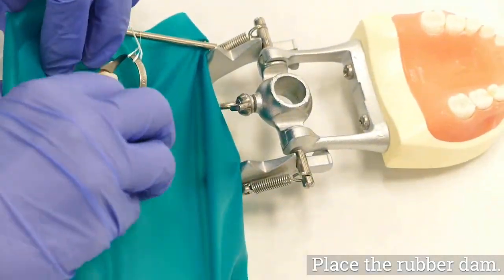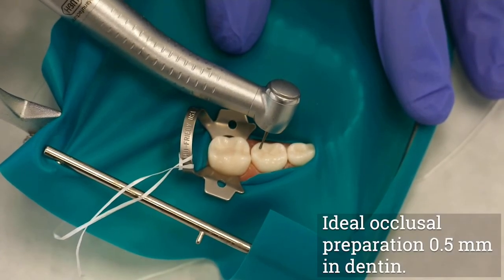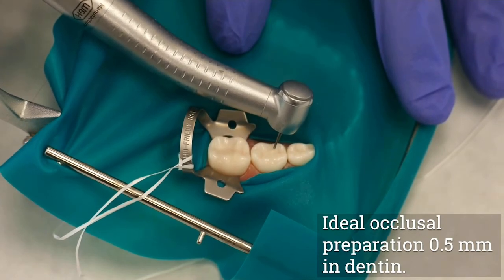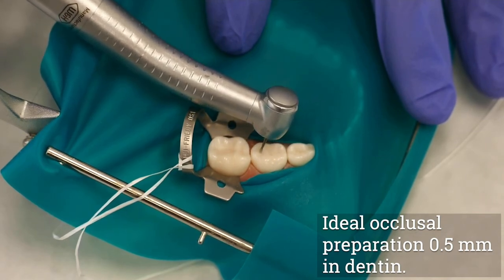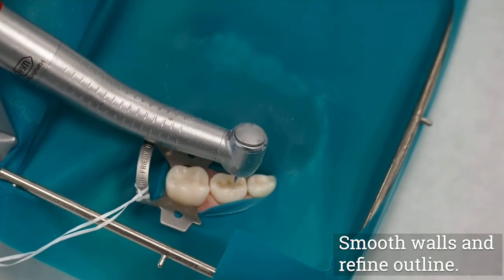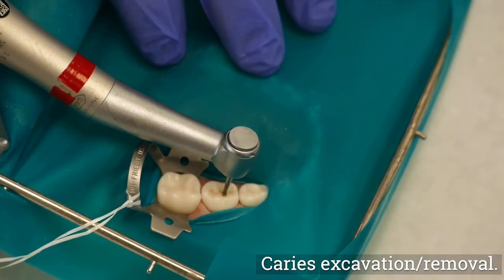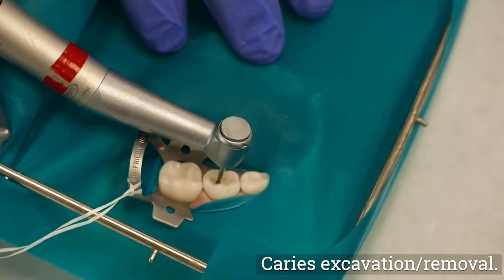Place the rubber dam. Using a number 330 bur in the high-speed handpiece, penetrate into the tooth parallel to its long axis in the central pit region and extend into all susceptible fissures and pits to a depth of 0.5 mm into dentin, approximately 1.5 mm to 2 mm. Smooth the enamel walls and refine the final outline form with the number 330 bur. Remove all carious dentin using a number 4 round bur in the slow-speed handpiece or a sharp spoon excavator.